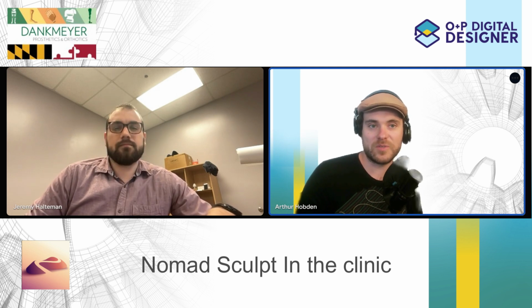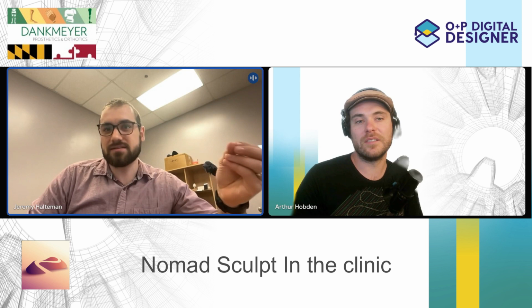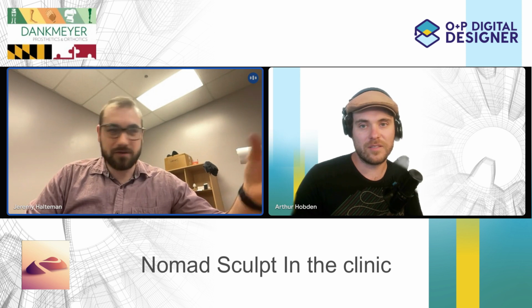Nice. So you're still designing templates in CAD, but your cutting tools, merging tools and wall thickness tools are in Nomad, unless it's something really basic. If I just need to drop in a cylinder that's X millimeters long with an X millimeter circumference, I can do that in Nomad very easily. But anything much beyond that, if I need a 4-hole cutting pattern, no, it's not built for that yet. I mean, you could do it; it'd just be very cumbersome.